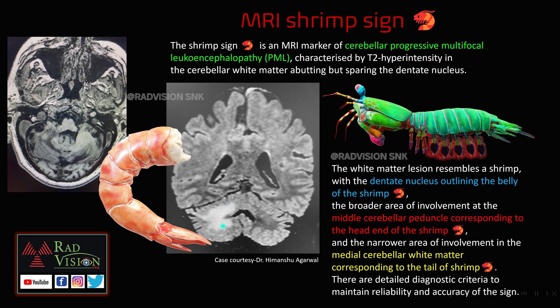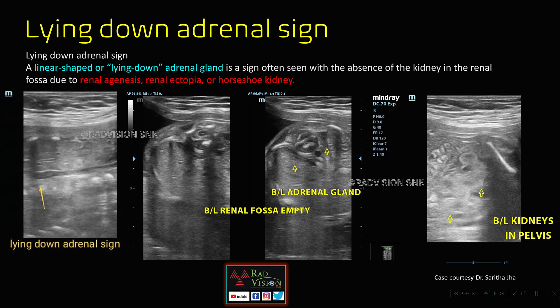The medial narrower area of involvement in the medial cerebellar white matter corresponds to the tail of the shrimp. Here you can also see this is the head, this is the body, and this is the tail of the shrimp — that typical Mrs. Shrimp sign seen in cerebellar progressive multifocal leukoencephalopathy.